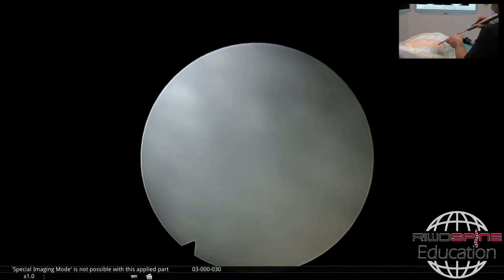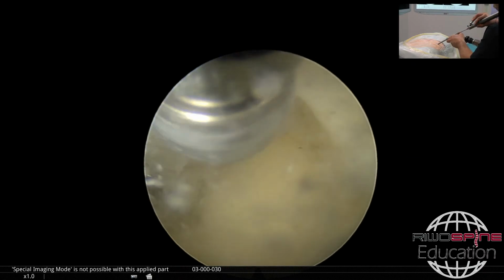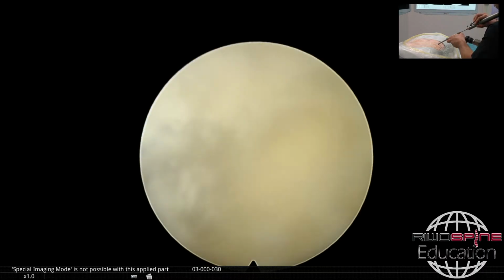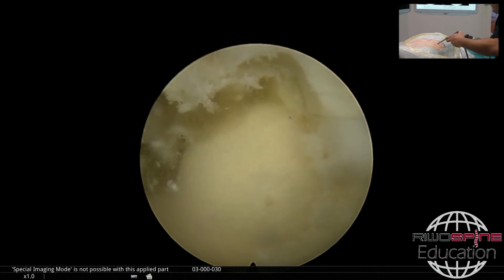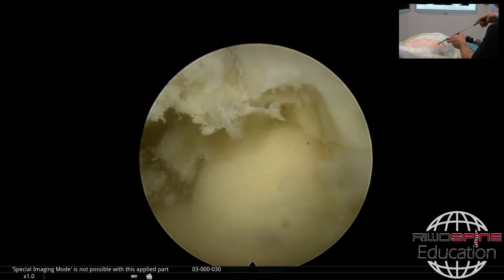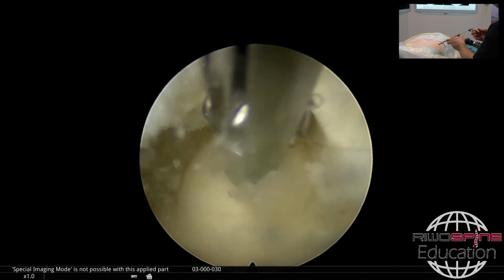Okay, now I have a bigger foramen right in front of me. And as we are focusing on the requirements from the Middle East, particularly during this webcast, one of them is, of course, that they are always asking for the local anesthesia possibility.